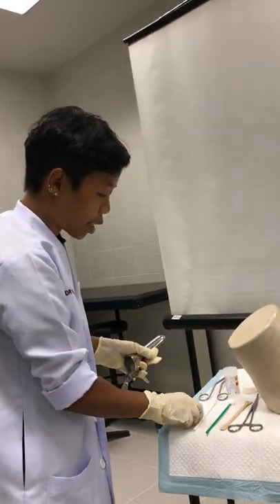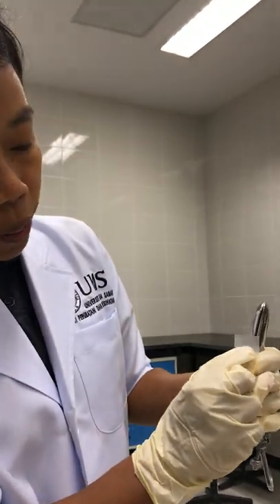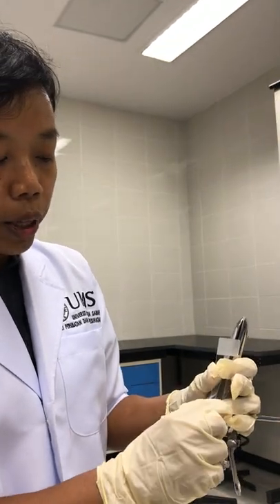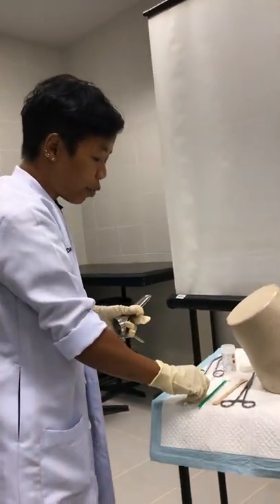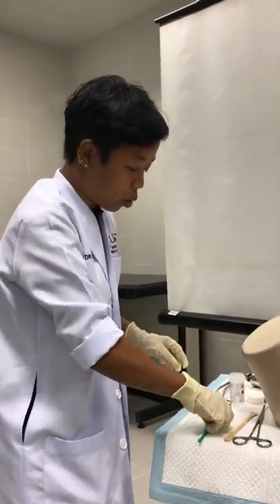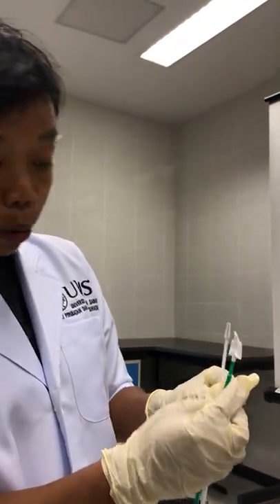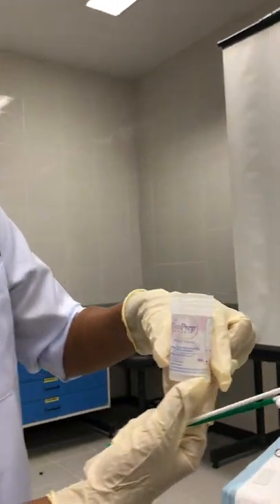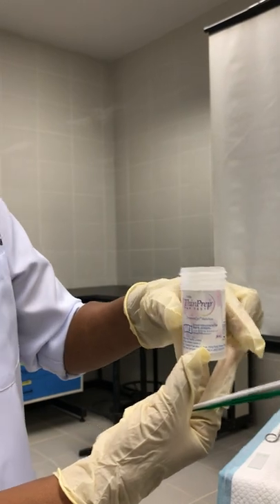Make sure all instruments are nearby. This spatula is for the conventional technique — the old method. If you use the spatula, you need a glass slide. You break down the patient's particulars on the glass slide, then use it to smear the cervical sample. If you are using the thin prep — the newer technique — you need the cytobrush and endocervical brush, along with the prep bottle, which is an alcohol-based medium called liquid-based cytology.